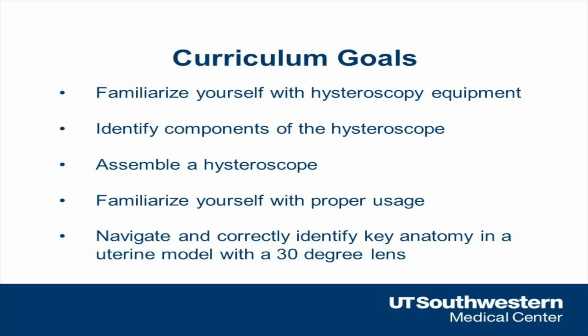Now you are ready to move on to part 2. In part 2, you will learn how to use your assembled hysteroscope to navigate a uterine model.